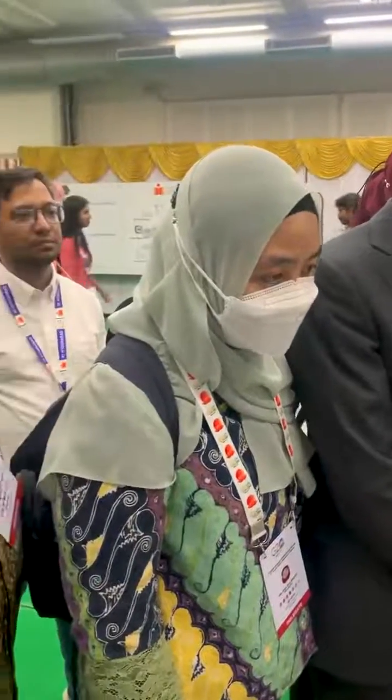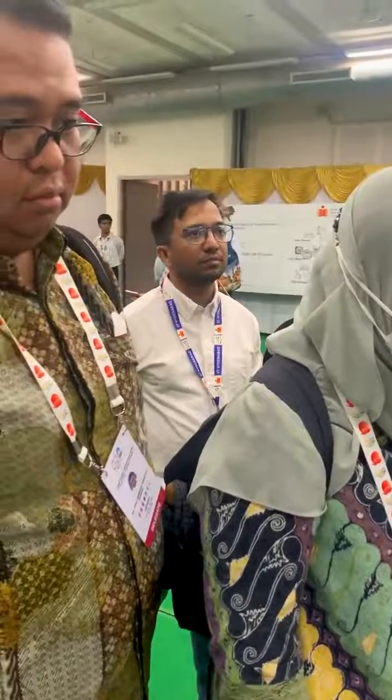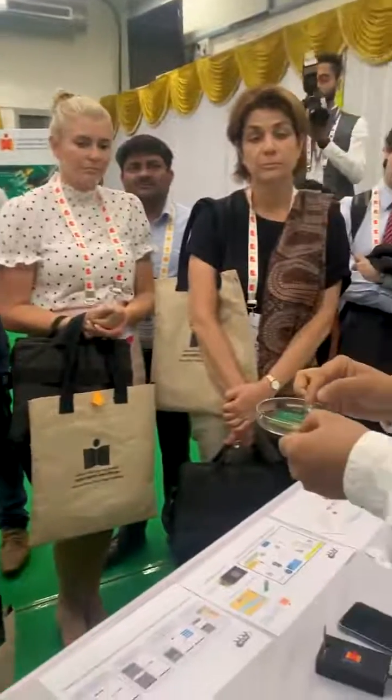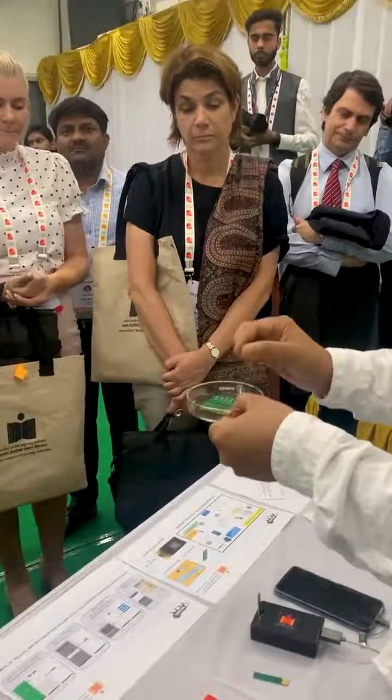Like that, we have different designs, and these can be used for different diseases. Maybe for cancer, we can use a different marker panel. So based on that, we can use the number of devices, whatever is needed.